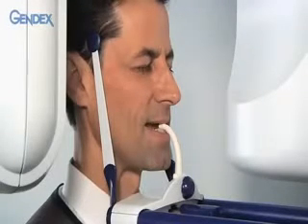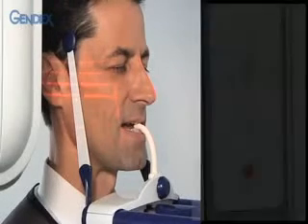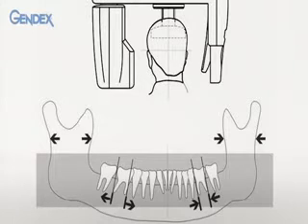Next, ask the patient to close his eyes. Switch the positioning laser lights on by pressing the appropriate button — these lights will switch off automatically after 45 seconds. For the first adjustment, focus on the front vertical light beam that should be centered on the patient's mid-sagittal plane, the midline.